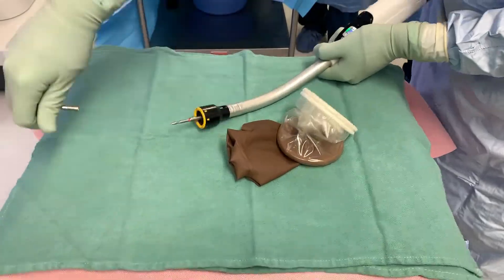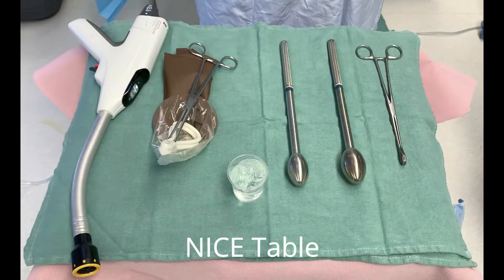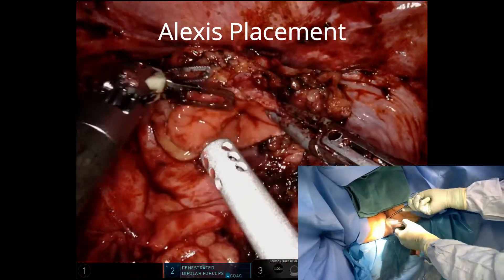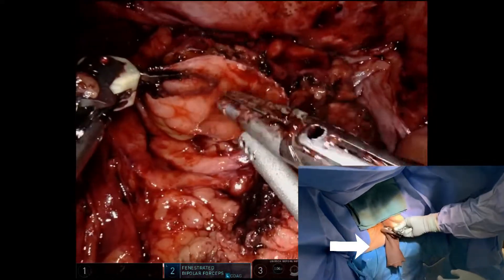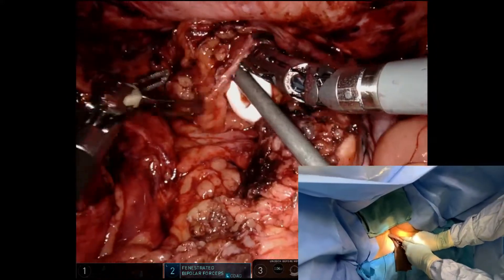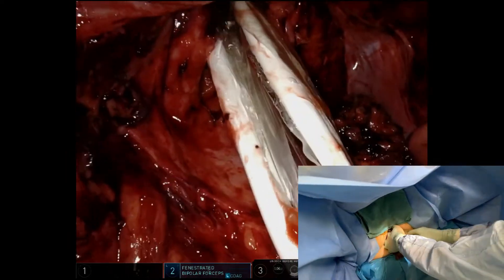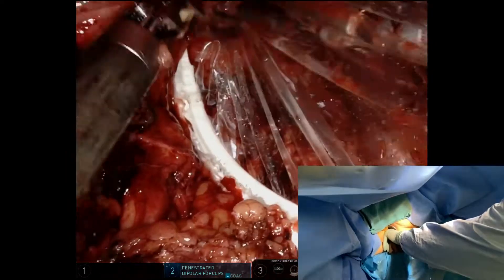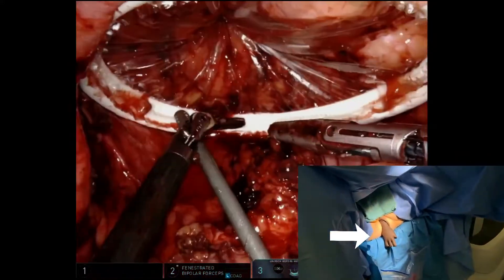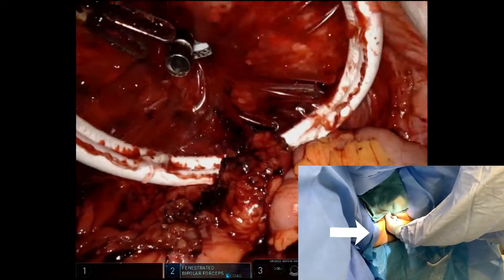There's an orthopedic glove that we attach to the rim of the Alexis — that's a small Alexis. There you see us putting in the anvil, and that's our back table. We introduce the Alexis like we always do, grab it with the Kocher retractor, and gently put the rim in through the rectal cuff. You see down below that we have the glove intact as we're doing this — it's going to capture any of the pneumoperitoneum trying to release through the rectum. We do the pull and push technique to get the Alexis in, and we see the glove fully expanded, showing the pneumoperitoneum.